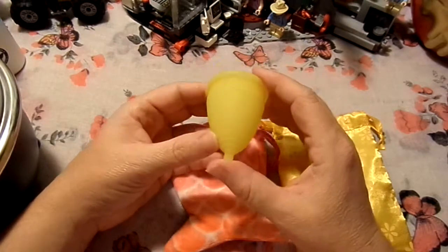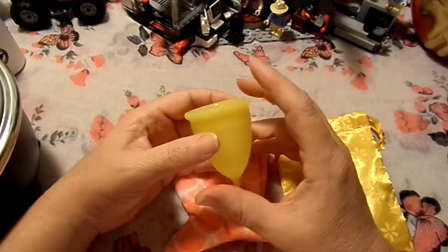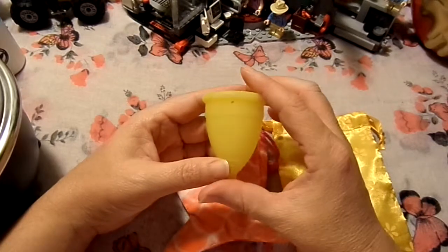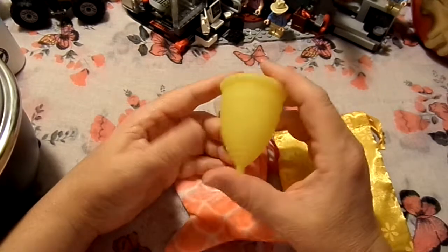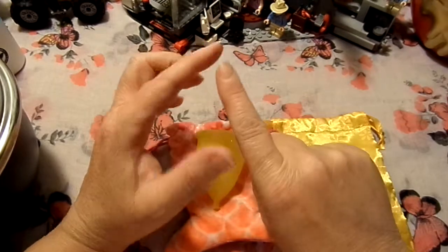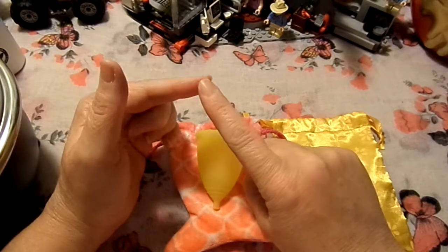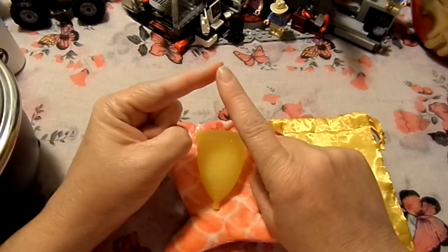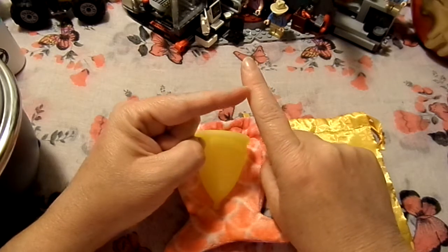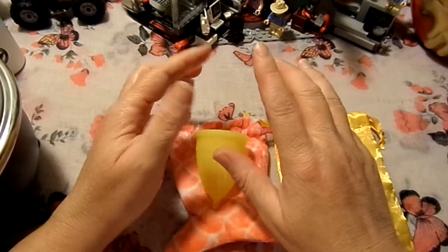On Instagram, Love Your Body, which also produces a menstrual cup, they have really good visual guides as well to show you what type of things you should be looking at. Essentially how they show you is with your index finger. If you put your finger inside yourself to try and find your cervix, this would be a high cervix, this would be a medium cervix, and this would be a low cervix, I think.